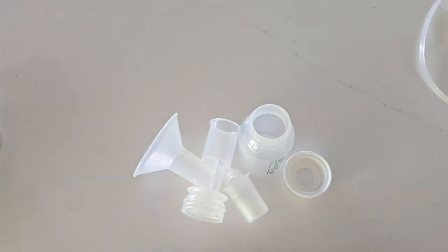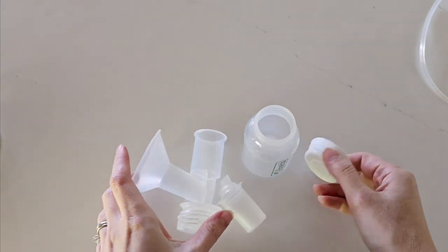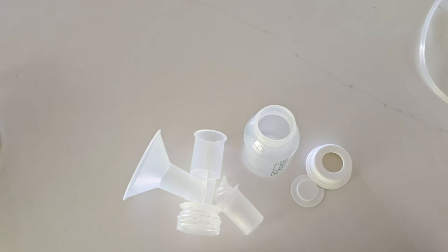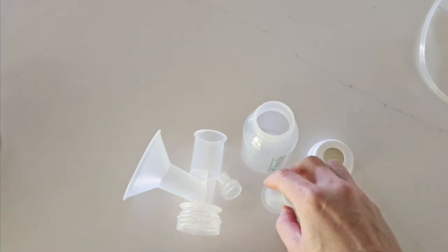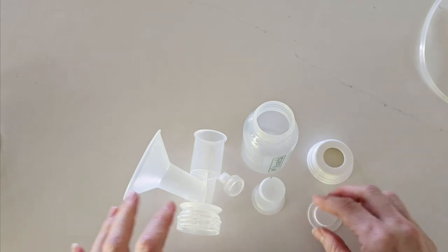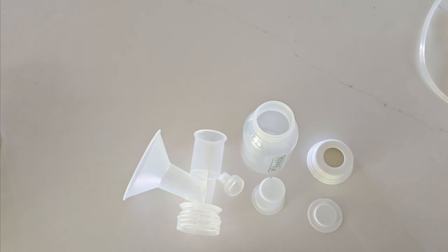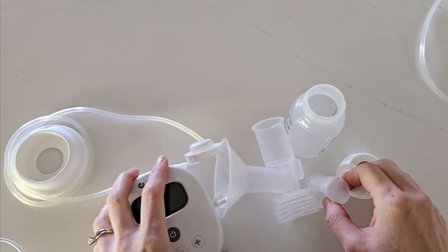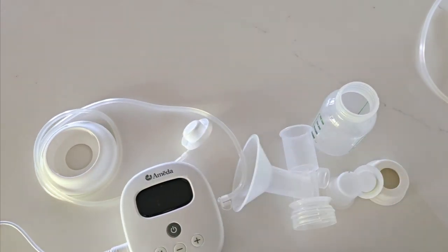Wash the contact parts in warm soapy water and then sterilize — you should be sterilizing at least once a day. To sterilize, simply boil these for around five minutes or use the Ameda microwave sterilizer bag. Once dry and sterilized, store them away for next time.